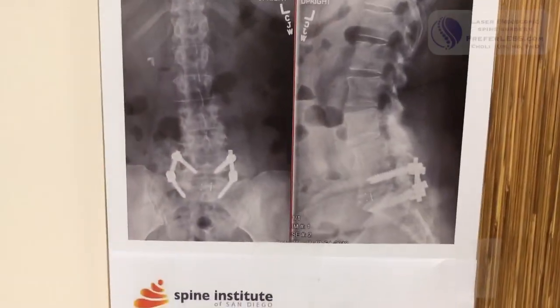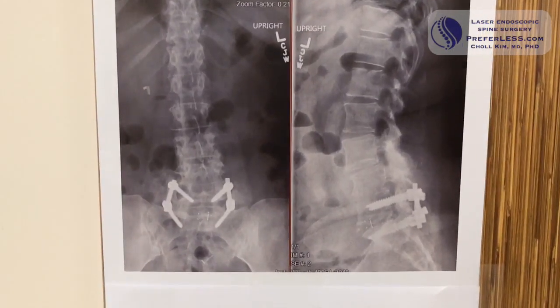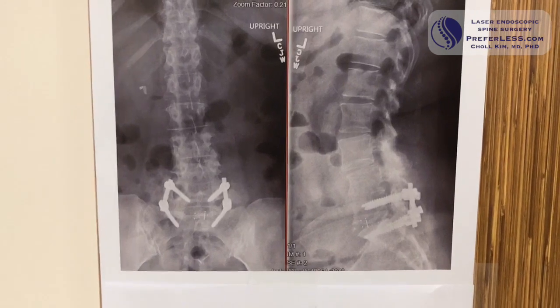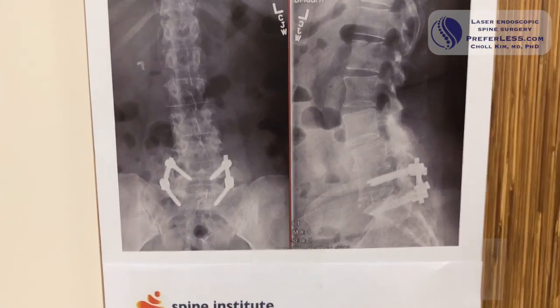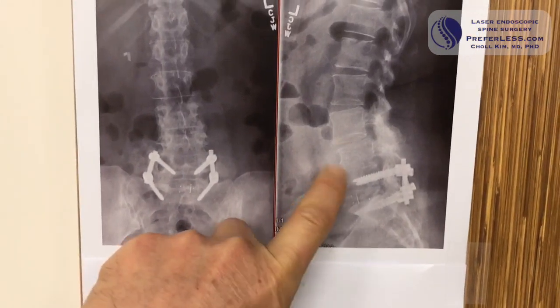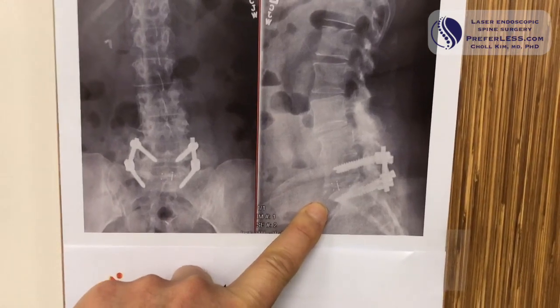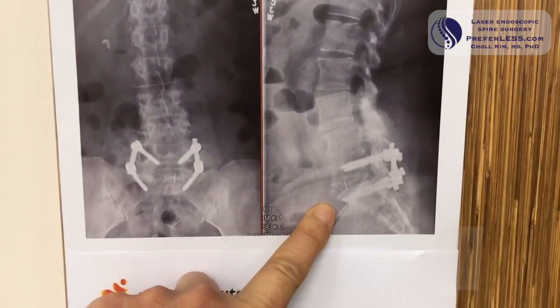We have a very challenging case today. We have a woman with seizure disorder, multiple sclerosis, and multiple previous surgeries. She had a previous 4 or 5 interbody fusion. That's fused, the hardware was taken out, and she developed adjacent level degeneration, and she underwent a 5-1 open TLIF.